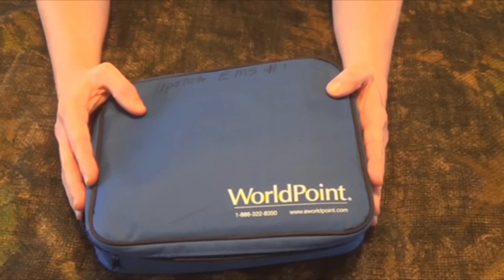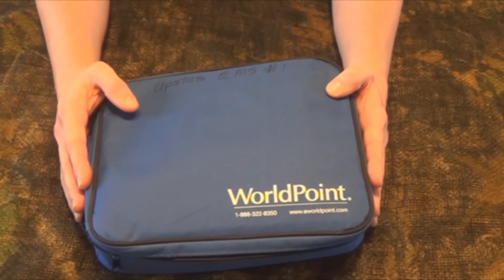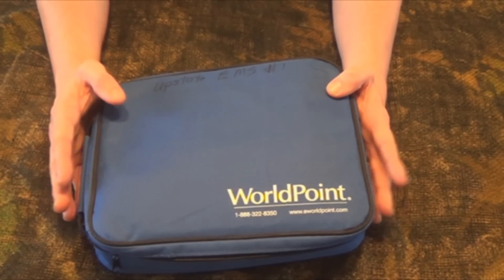Hey YouTube, welcome to another video from Skinnymedic. In my last few videos I've been talking about doing CPR, so I felt like it was necessary to cover how to use an AED — an automated external defibrillator.